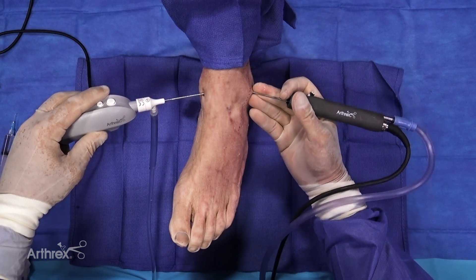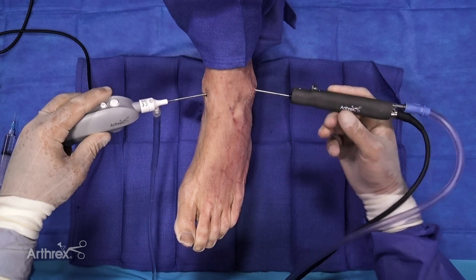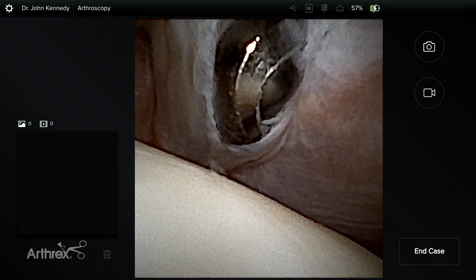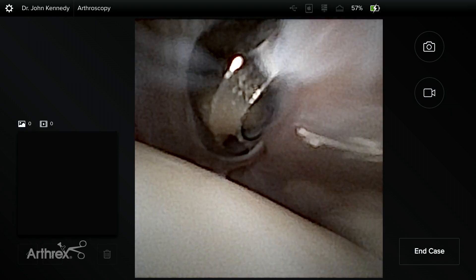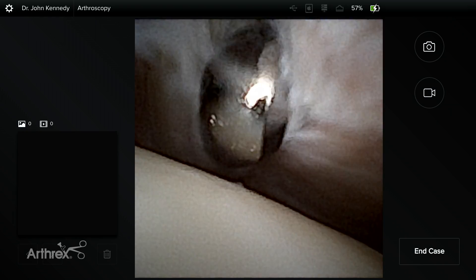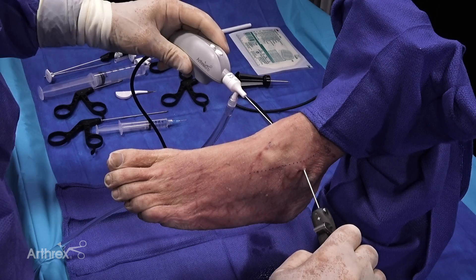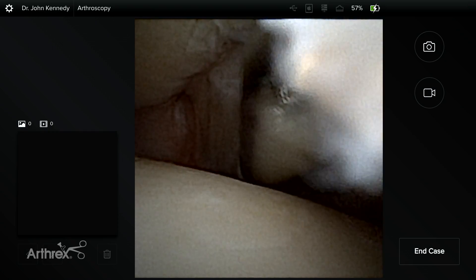Now we advance our two millimeter scope, and as we advance our two millimeter shaver, you can see — as you would normally — we can put on a little bit of suction and it starts to shave some of that cicatrized tissue at the anterolateral aspect of the joint. As we continue to do that, the image quality here is second to none.